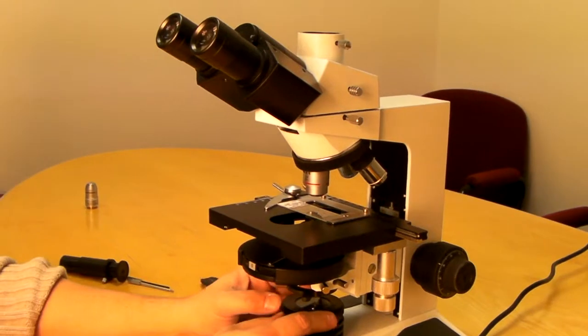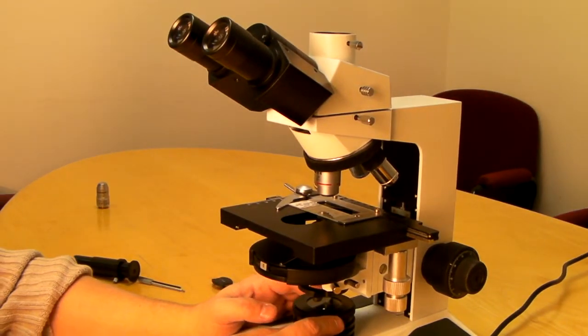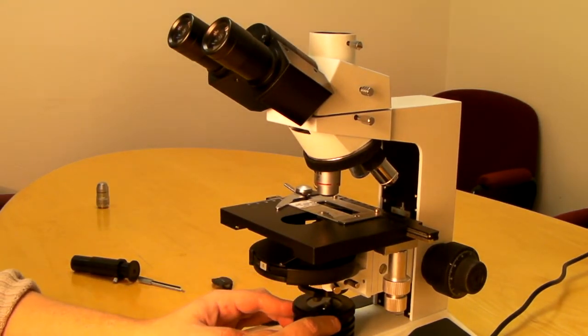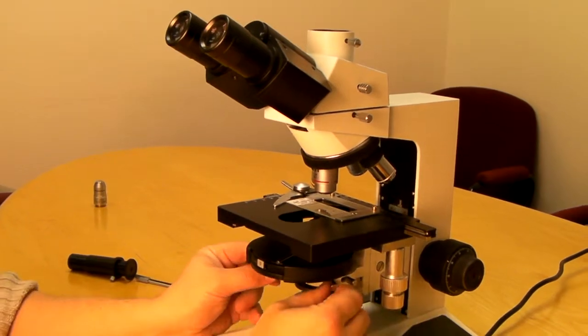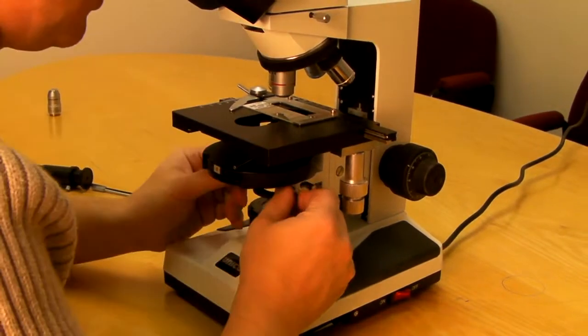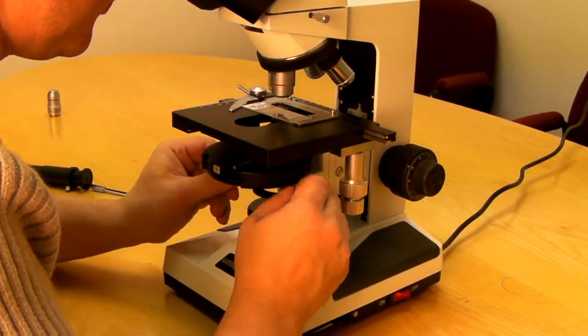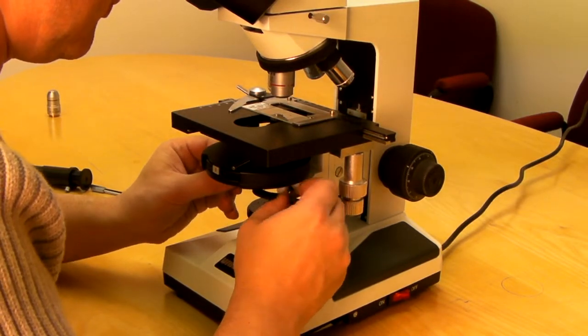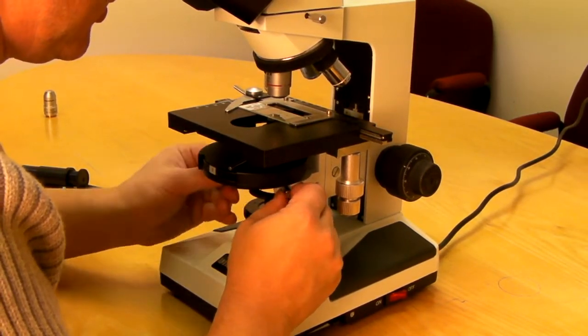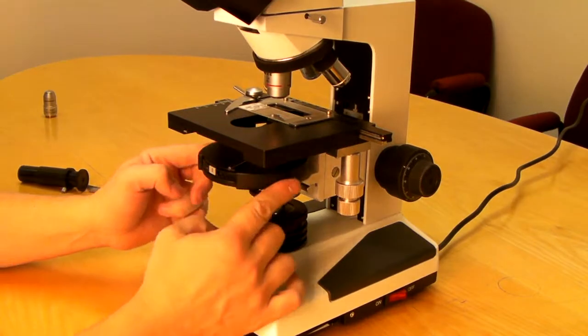You will see a small bright spot in the center of your field. If it's not in the center, use these two screws to position the condenser in the middle.